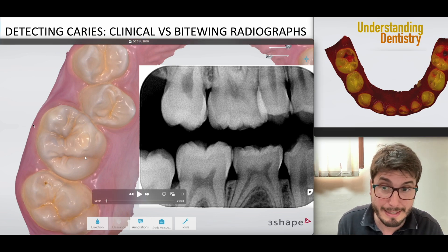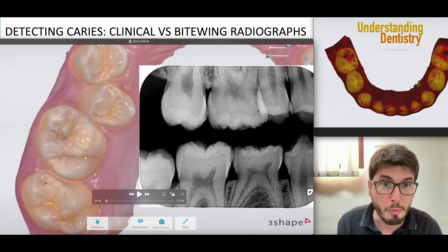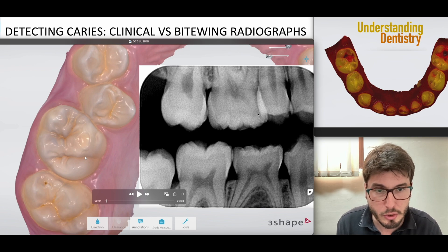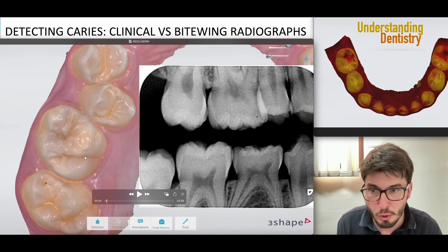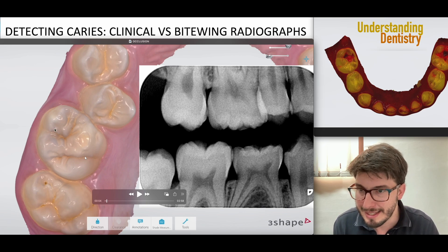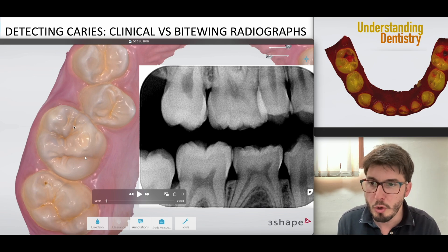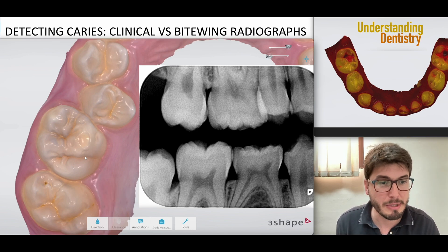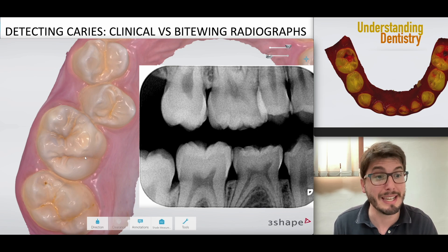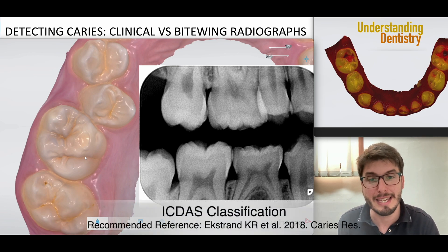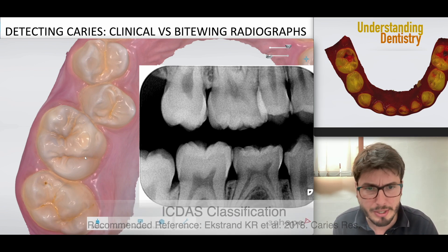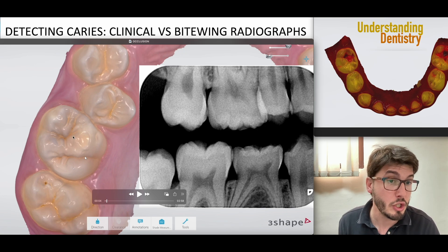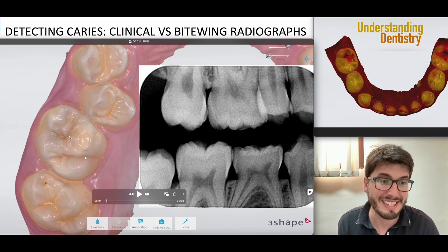We need to understand changes in the dentine — always compare the radiopacity of the dentine in relation to areas that are more radiolucent. The clinical presentation of the tooth is the gold standard for occlusal caries; the gold standard assessment method is the clinical assessment — the ICDAS classification. Understanding ICDAS is very important because we can differentiate initial from moderate from extensive lesions.